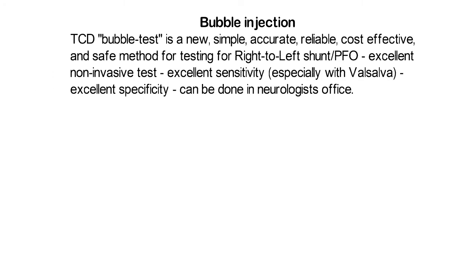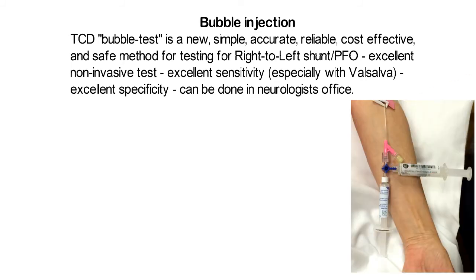Bubble injection. The TCD bubble test is a new, simple, accurate, reliable, cost-effective, and safe method for testing for right-to-left shunt PFO. Excellent non-invasive test, excellent sensitivity, especially with Valsalva. Excellent specificity, can be done in a neurologist's office.